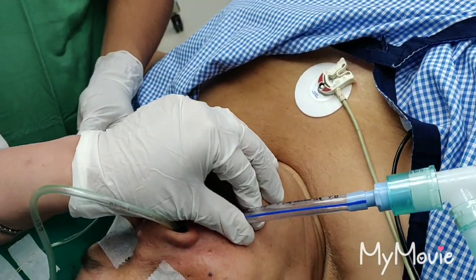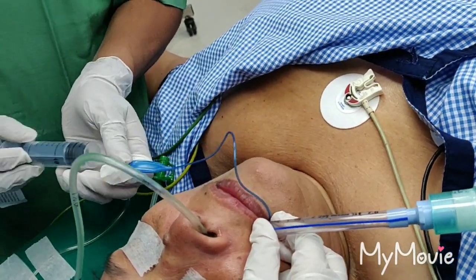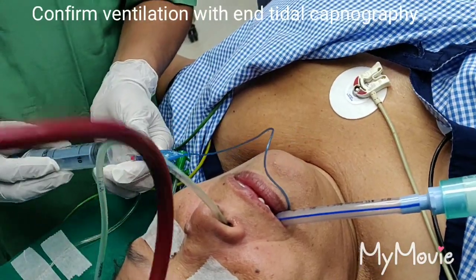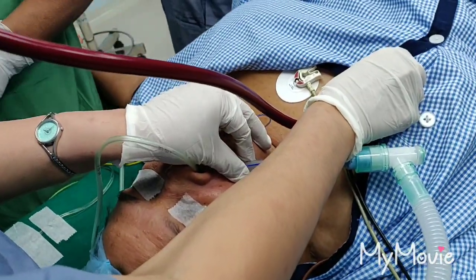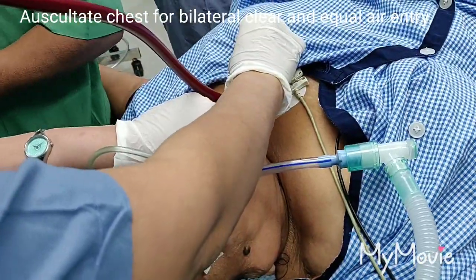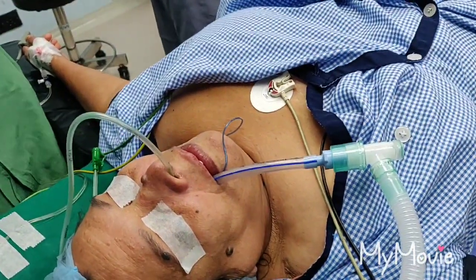Check for ventilation. Bagging. Good chest expansion. Capnography. Bilaterally clear air entry. Thank you.